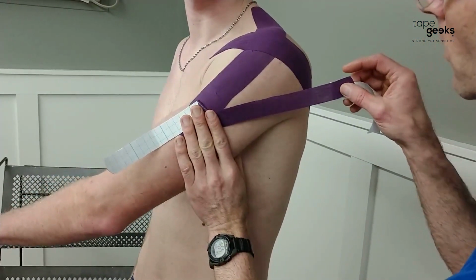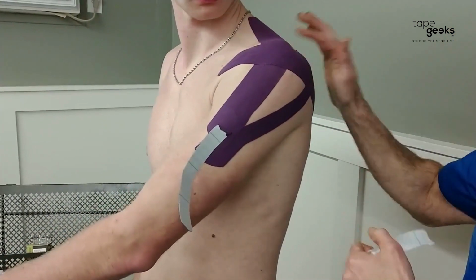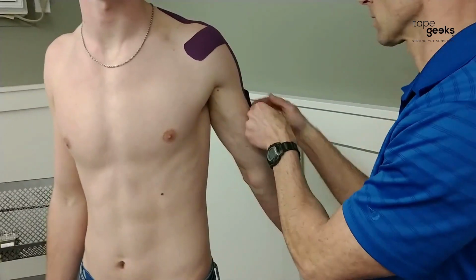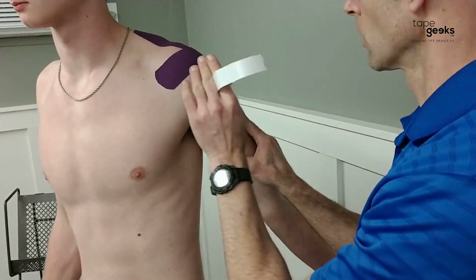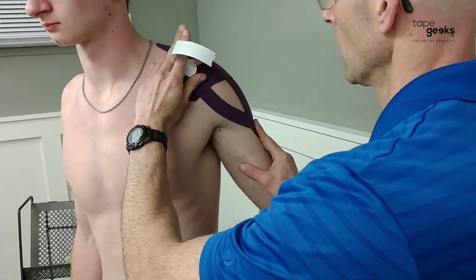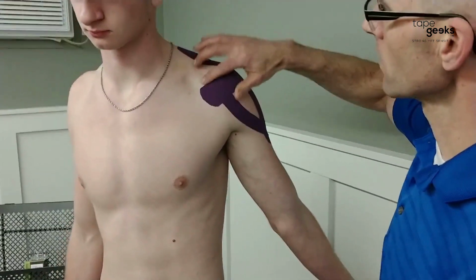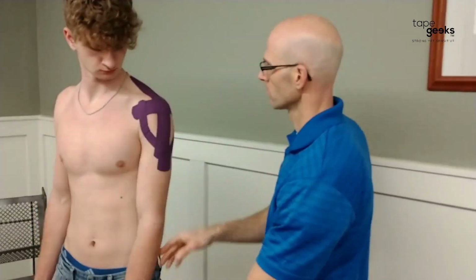About 15 to 20%. Bring it on up around the deltoid. And end without tension. Now this one is going to bring it back like that. Get that deltoid, the anterior deltoid, on stretch. Again, 15 to 20% for this particular tape job. No tension on the end. And again, you want to try to end where it's on skin. I lucked out, got a little bit of skin there. A little more would even be better. Okay, bring it on down.